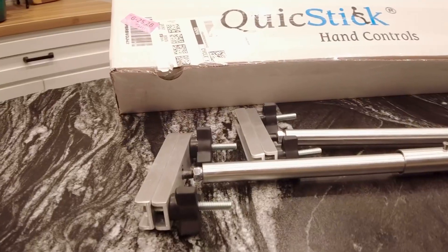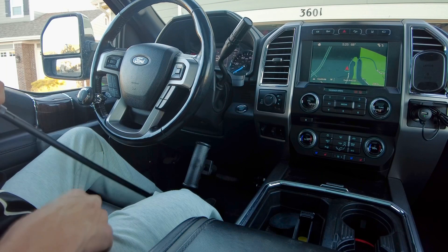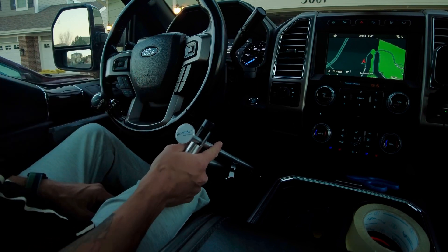Back to check out a second portable hand control system. Last time we checked out the Pedal Master — this time we're checking out the Quick Stick. This one actually clamps to the pedals, so it's a bit more of a semi-permanent install than the Pedal Master. The Pedal Master you simply pull the trigger, clamp it to the pedal, and go. The Quick Stick has two aluminum clamps with large wing nuts that need to be tightened down, which means if somebody else wants to drive the vehicle, these will have to be removed for them to use the standard pedals.